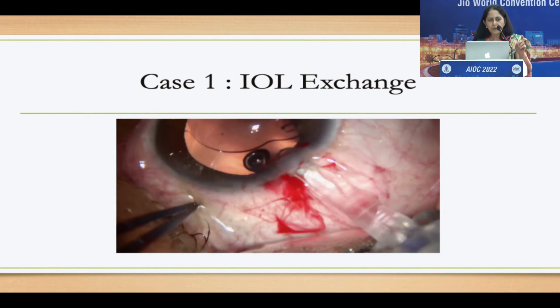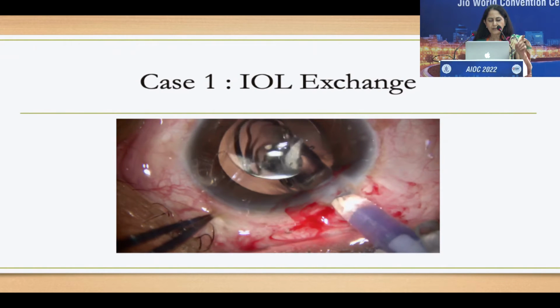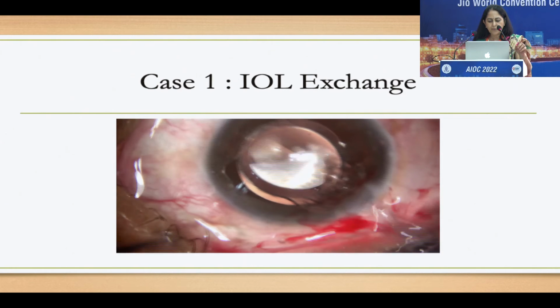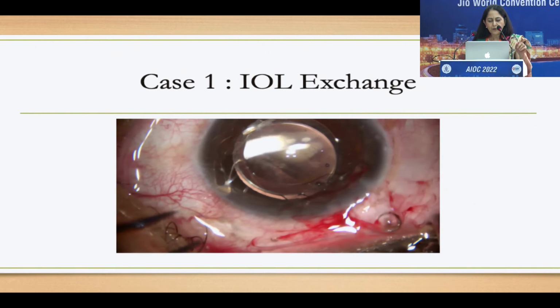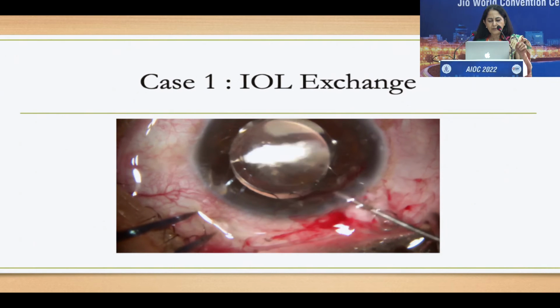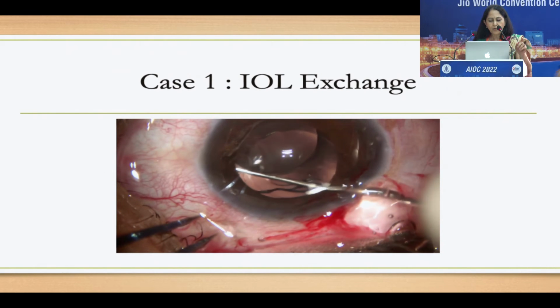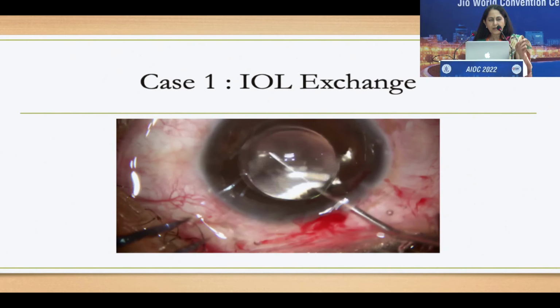And the technique which I do is the scaffold technique. Once I've placed it onto the anterior capsule, I put in the intended IOL inside the bag. It's easy to dial it in. Once you've dialed it in very gradually under this lens which needs to be exchanged, now you're at least sure that your posterior capsule is well guarded.